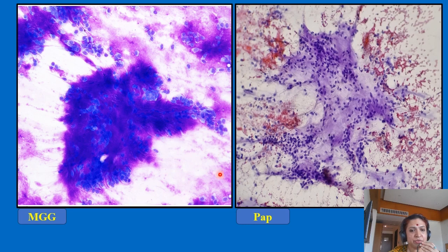So this is the importance of doing an MGG and Pap stain. This is a classical case of pleomorphic adenoma. You can see that in the Pap stain also we are seeing matrix, but how beautifully this is brought out in the MGG stain, with that feathery quality with the cells embedded within the fibrillary matrix, that is more classically brought out with the MGG stain.